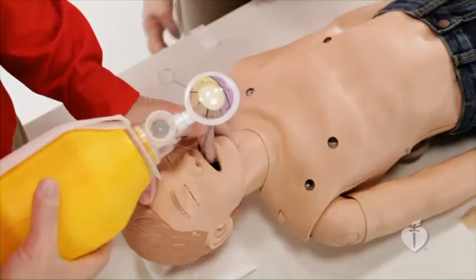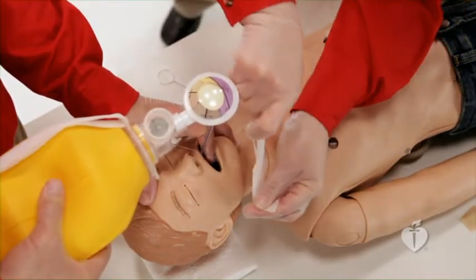Once tracheal tube position is confirmed, secure the tube. There are many ways to secure the tracheal tube in an infant or child.